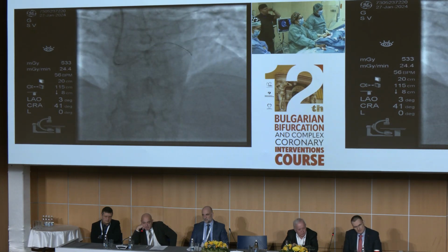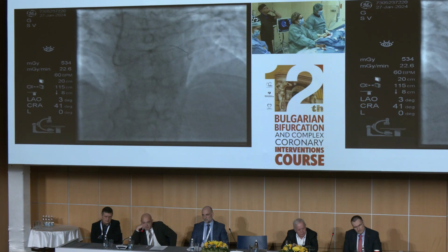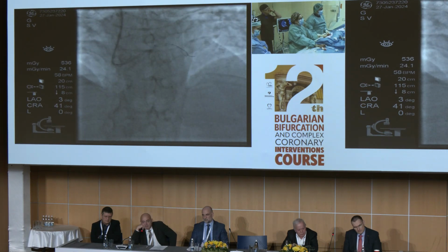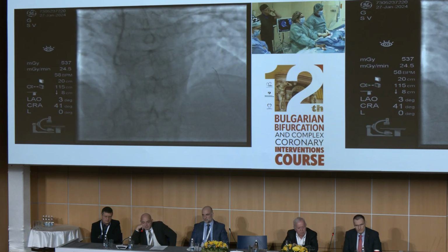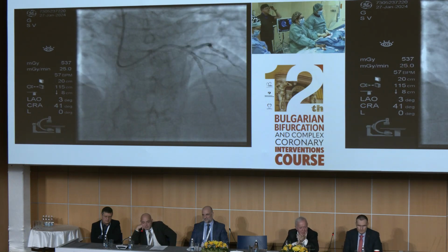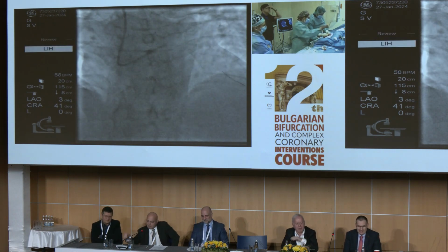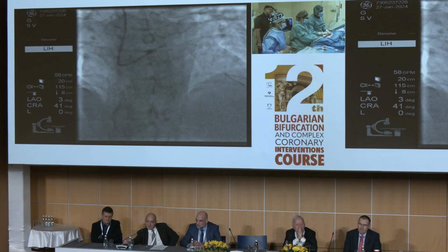Sorry, men can do only one thing at the same time. Women are multitask. But yeah, the wire is a bit hesitating to re-enter the vessel. But okay. So, thank you.